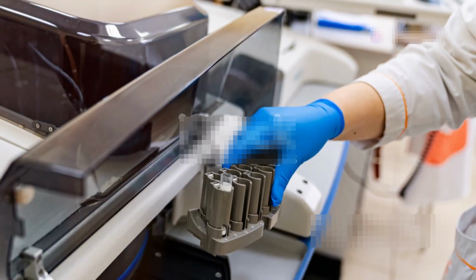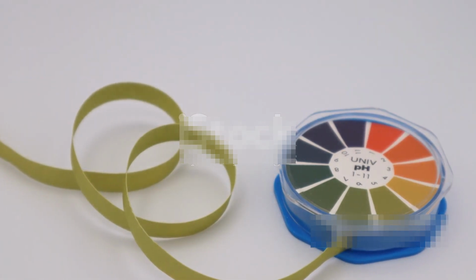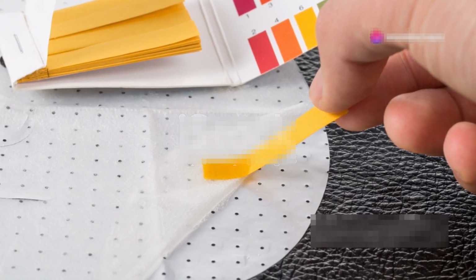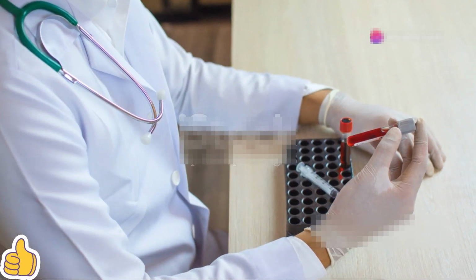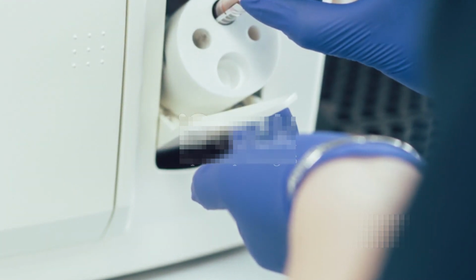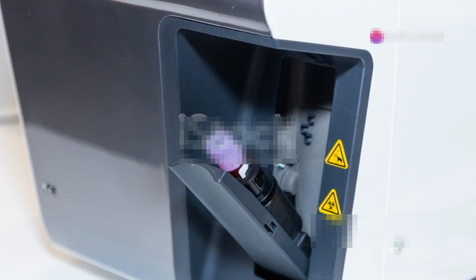First up, pH. This tells you how acidic or alkaline the blood is. The normal range is 7.35 to 7.45. Low pH, acidemia, if it's below 7.35. Respiratory acidosis, due to high PaCO2. Metabolic acidosis, due to low HCO3: diabetic ketoacidosis, lactic acidosis. Symptoms: confusion, lethargy, rapid breathing.